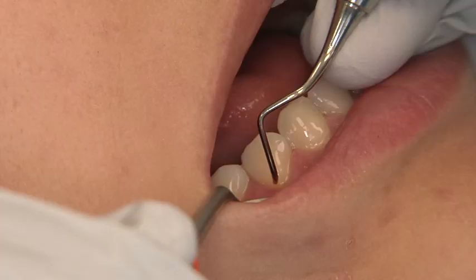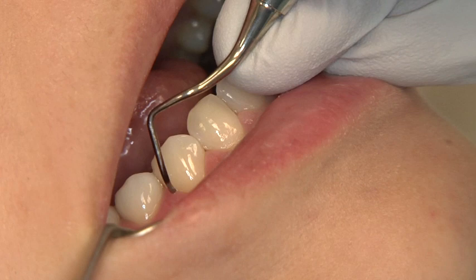Position the terminal shank parallel to the long axis of the tooth at the distal line angle, with the toe of the Gracey 1718 directed towards the back of the mouth. This is done by holding the instrument close to the tooth, with the toe facing distally in the direction of instrumentation. Parallelism of the terminal shank in relation to the long axis of the tooth is established correctly when the functional shank appears to go up and over the tooth.